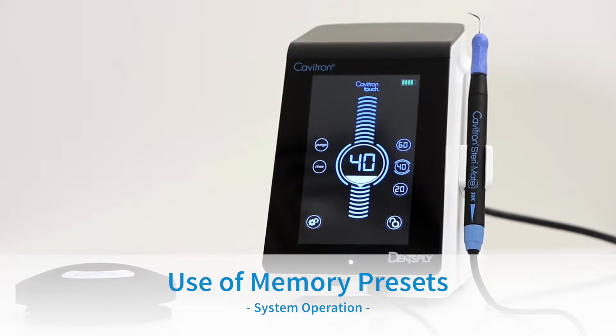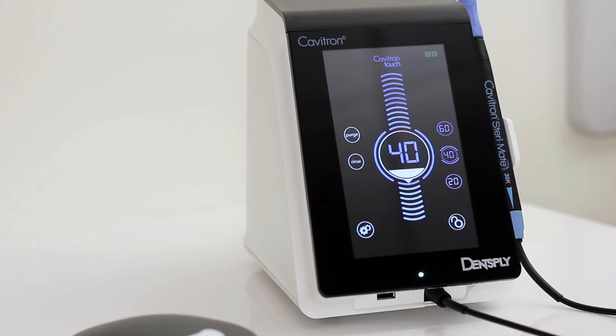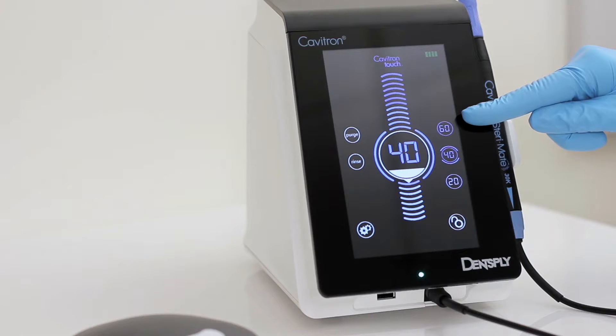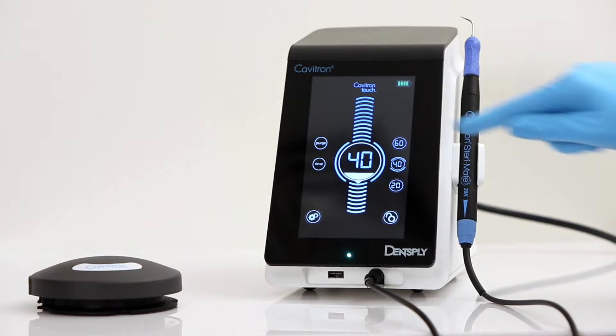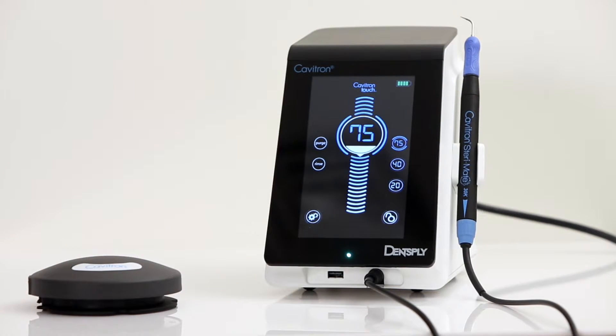Use of Memory Presets: The user can adjust the power level for increased power. 3 power preset options are available. The factory settings for the presets are 20, 40, and 60. Please adjust the power level to your desired output and press and hold the preset button until the sound indicator is heard to select the desired preset.